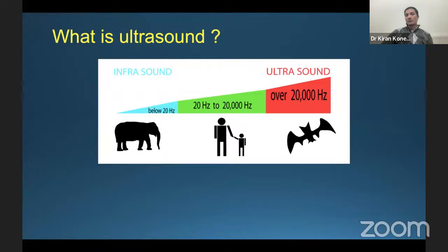mainly for central venous cannulation, et cetera, to avoid complications. So that has led to further use of ultrasound as a safer measure for regional anesthesia. And slowly, it has been a history since then. In the last two decades, ultrasound has made significant progress, going from being used only in diagnostic and non-anesthetic settings to even bedside settings and even in emergencies, quite significantly by many clinicians, which has been helpful for clinical users.